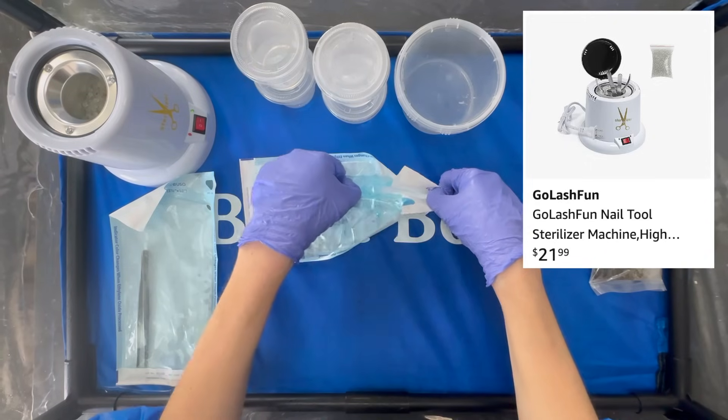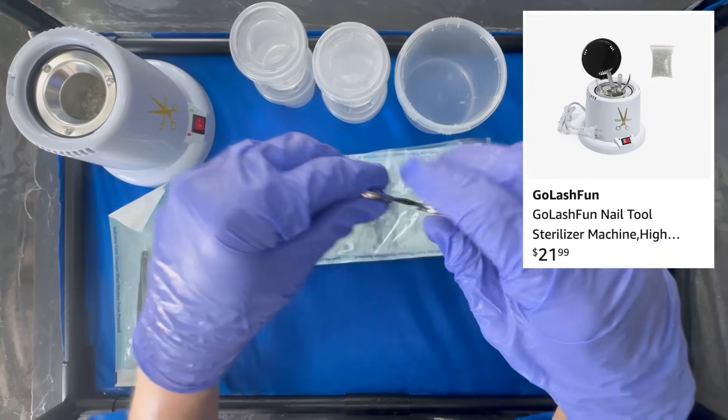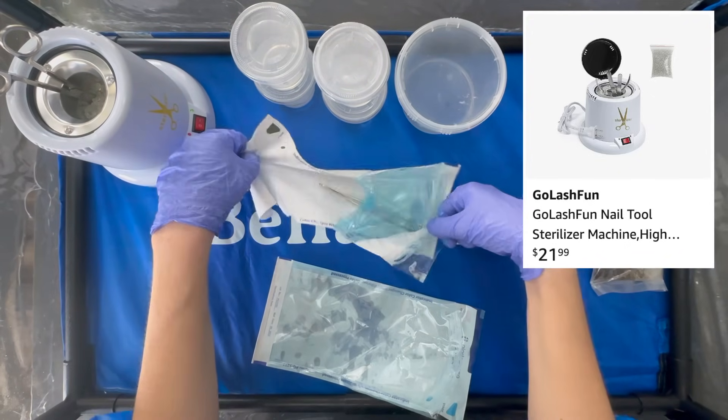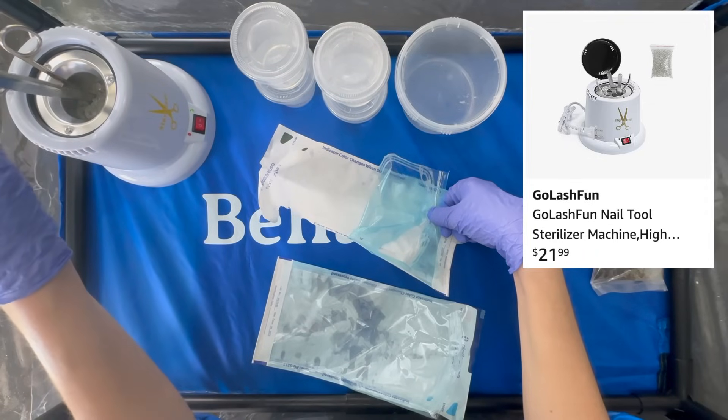If you can't find a nice glass bead sterilizer secondhand, you can also get cheap ones from Amazon. These ones are primarily used by nail technicians, I think. And although they don't heat up as hot as a lab-grade glass bead sterilizer would, I've still found them effective for doing plant tissue culture.